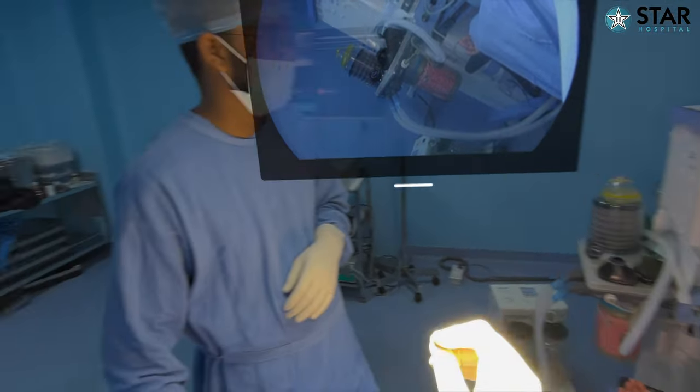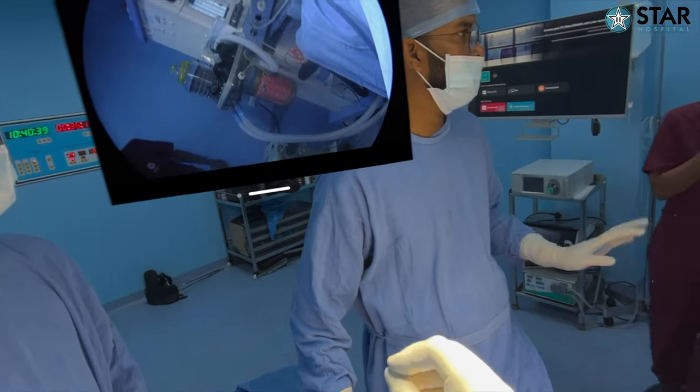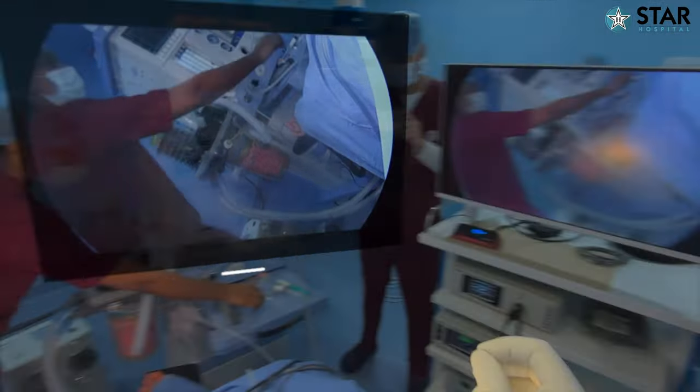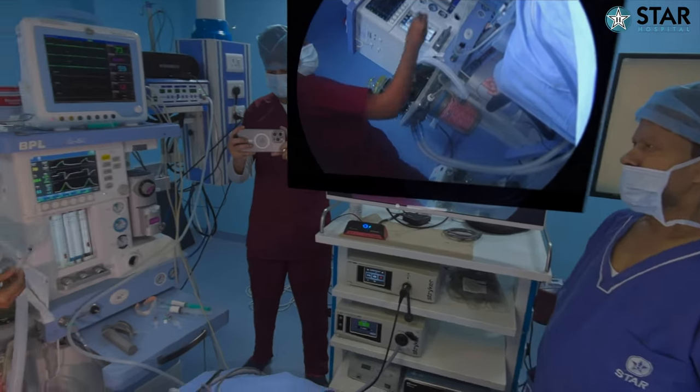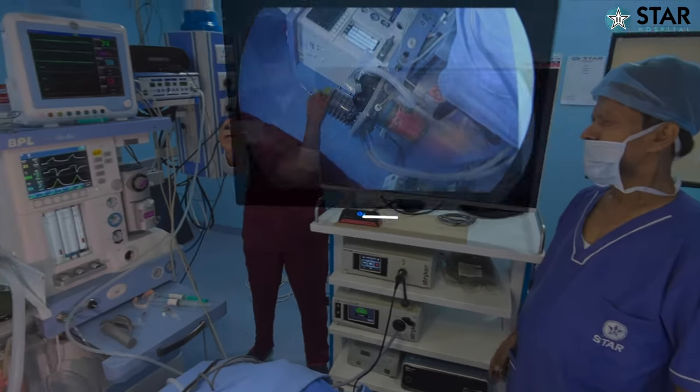I can rotate this in various directions. When operating down, I can keep it here; if I'm operating upside, I can keep it there. That is the beauty — you get to see things much more clearly and at an angle that is very comfortable to you.